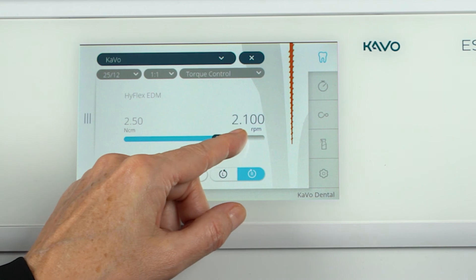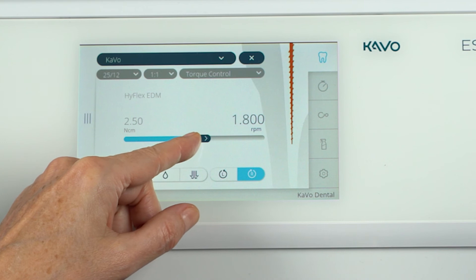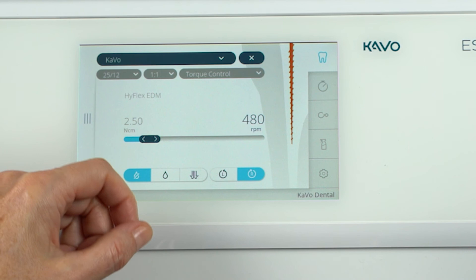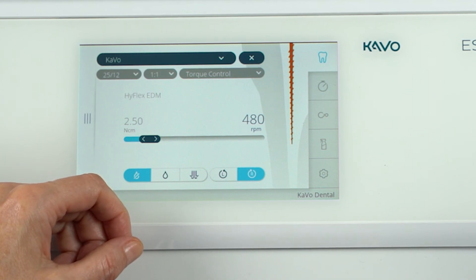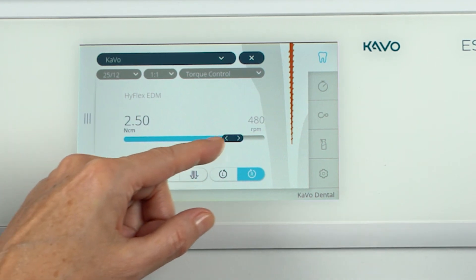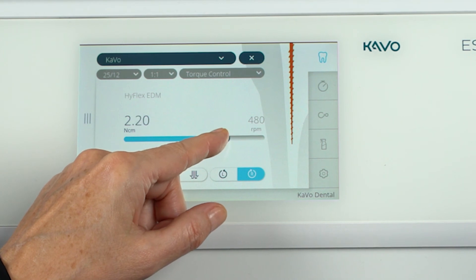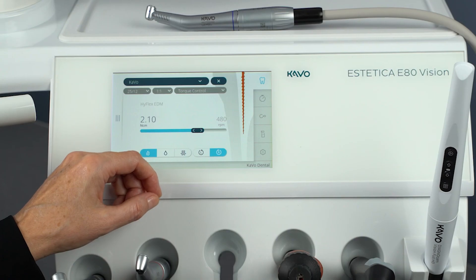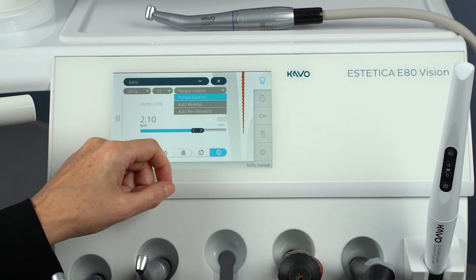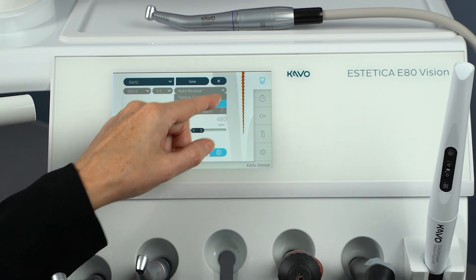To set the speed, tap on the current speed value and set the desired speed with the slider — the speed is shown on the display and takes effect immediately. To set the torque, tap the current torque and set the desired torque with the slider. The torque is shown on the display and takes effect immediately. You can choose between three torque modes: Torque Control, Auto Reverse, and Auto Reverse Forward.